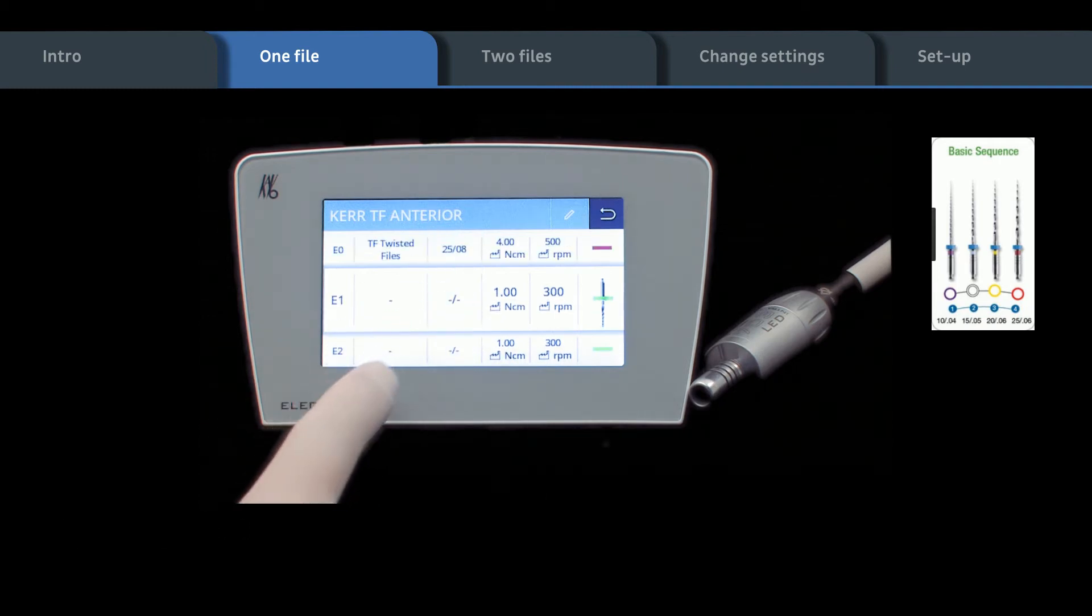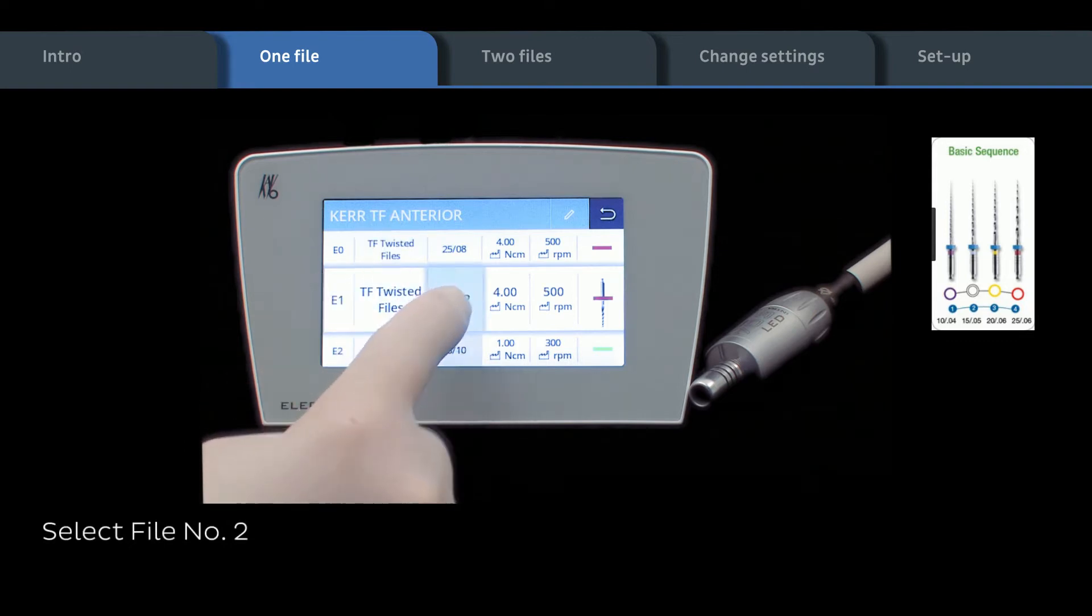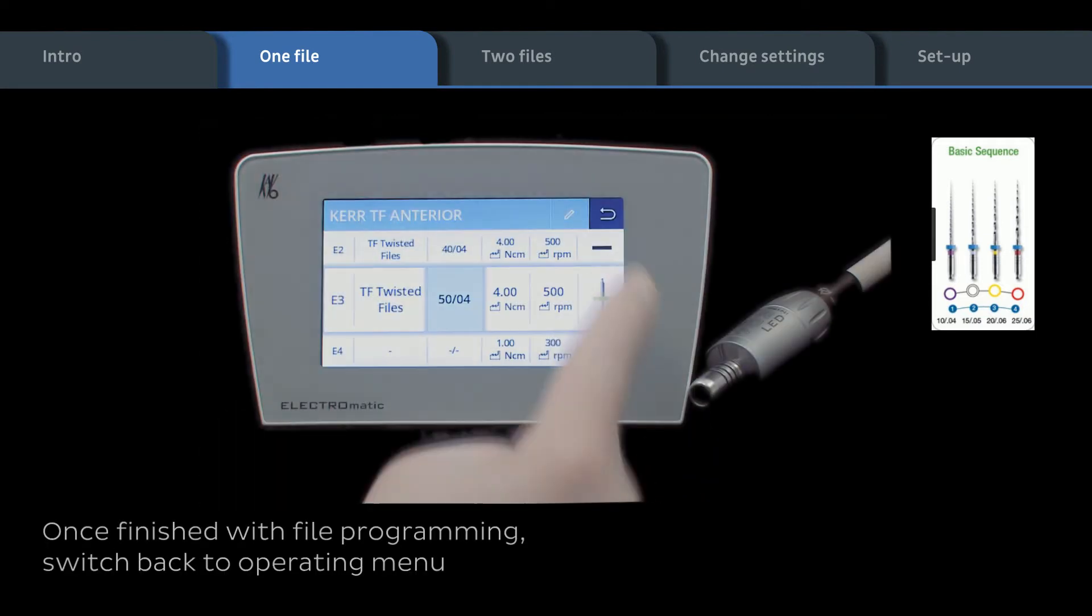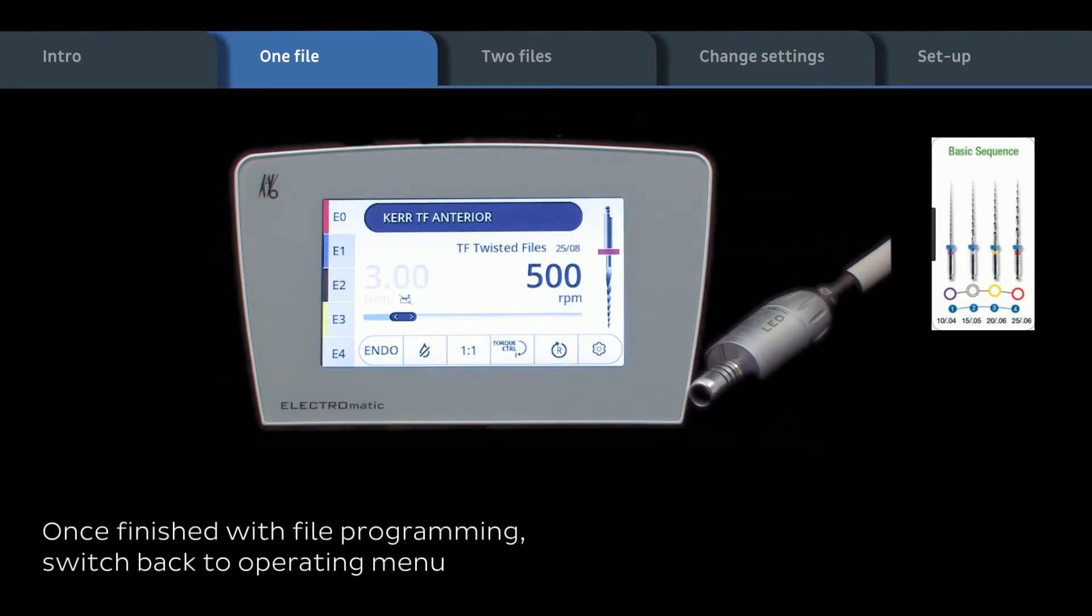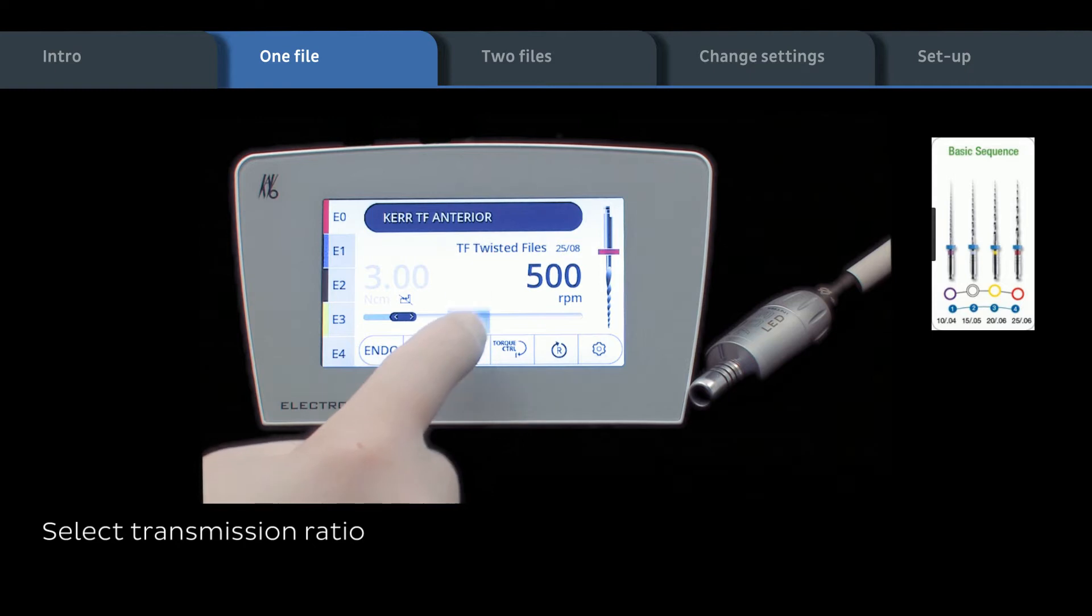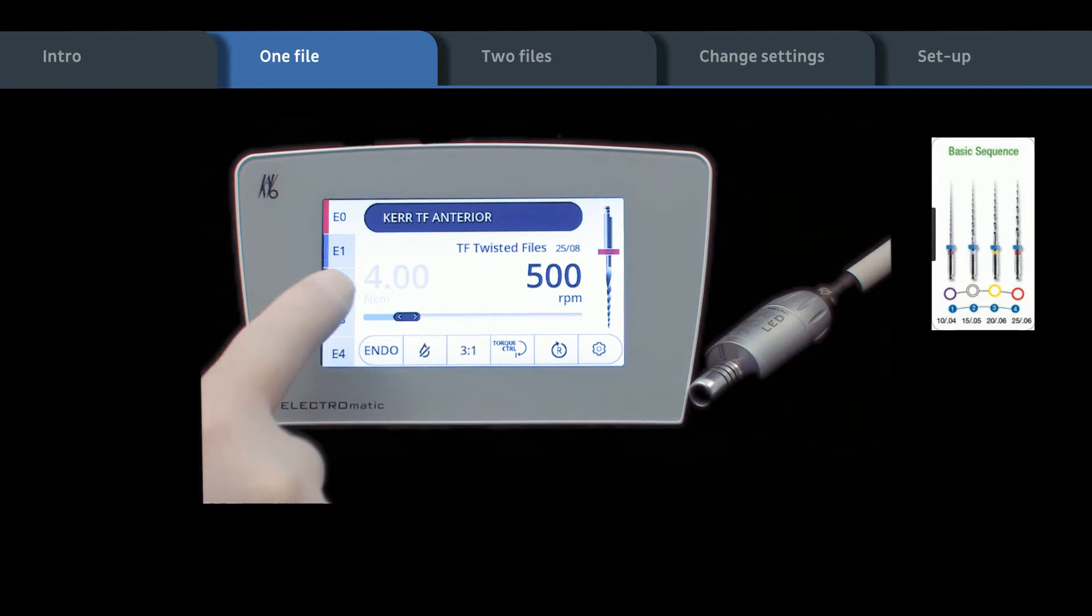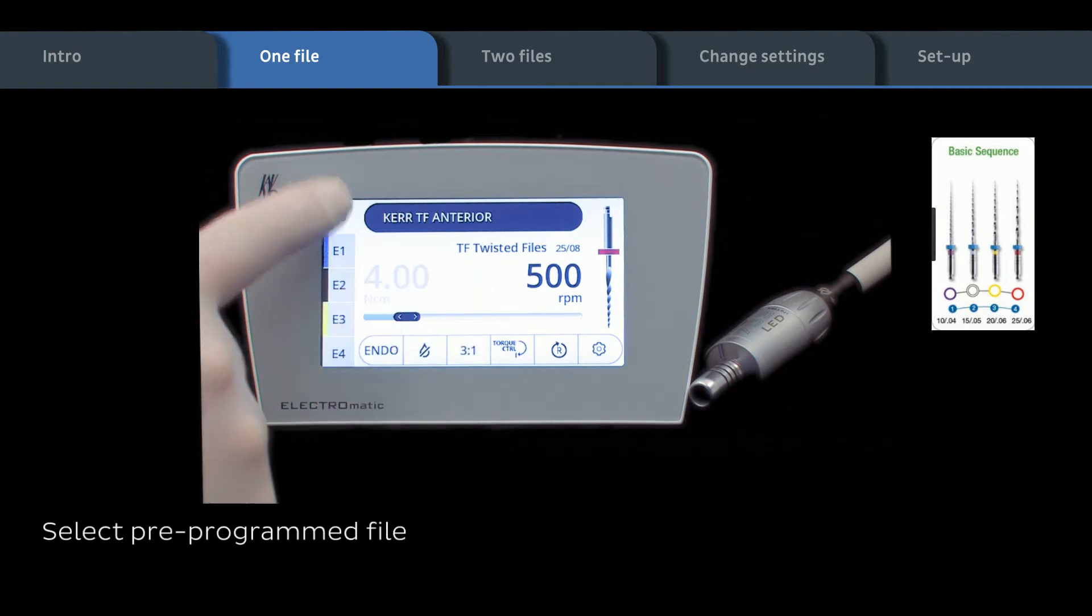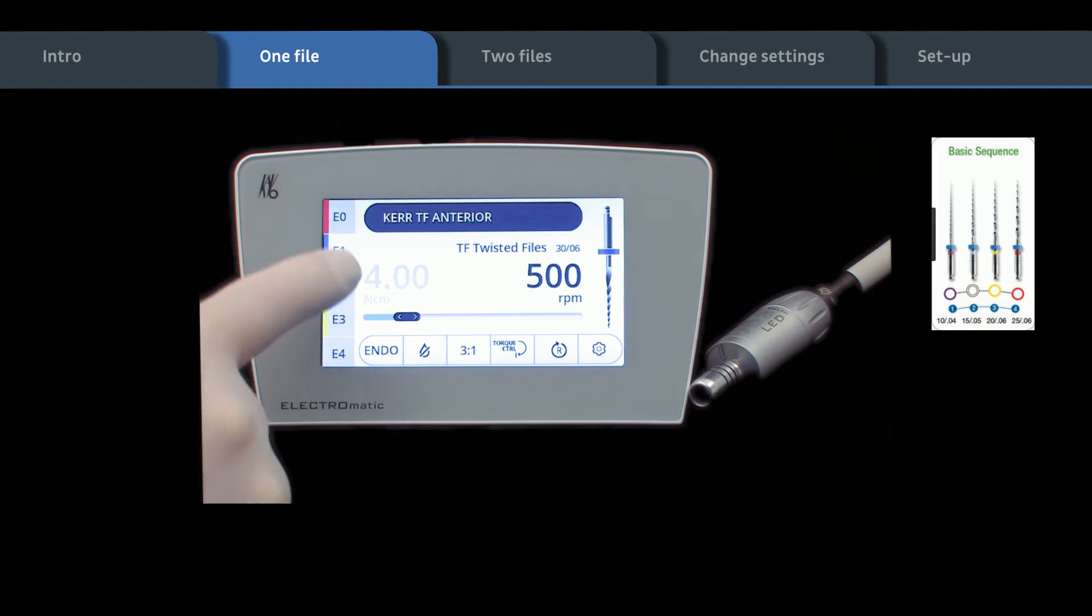Select further file system and file type from database and add up to 10 steps per sequence. When all desired files are programmed, switch back to operating menu. Select transmission ratio of attached endo handpiece. Select and control relevant preprogrammed endo file.